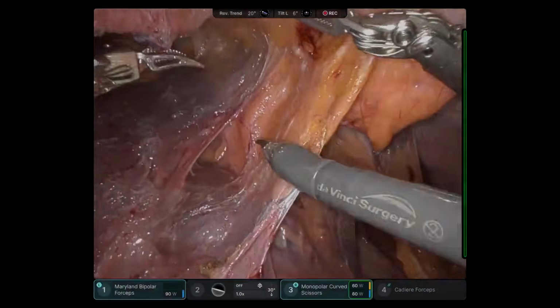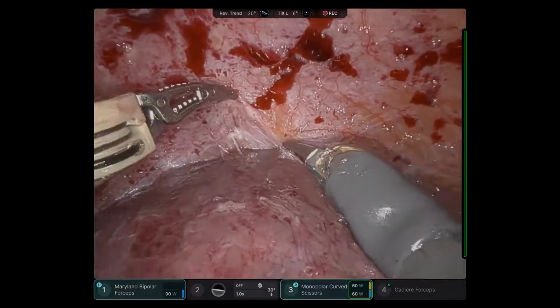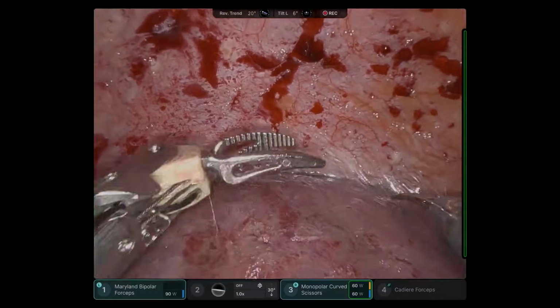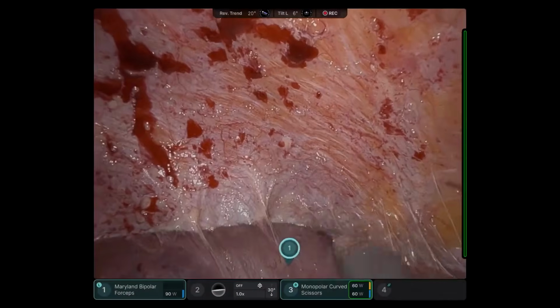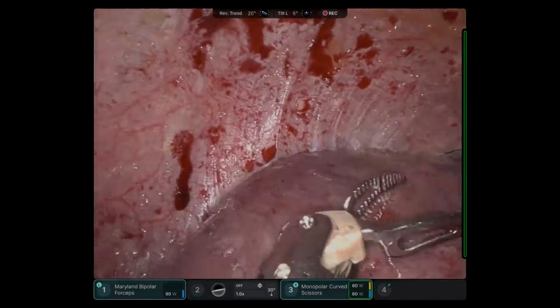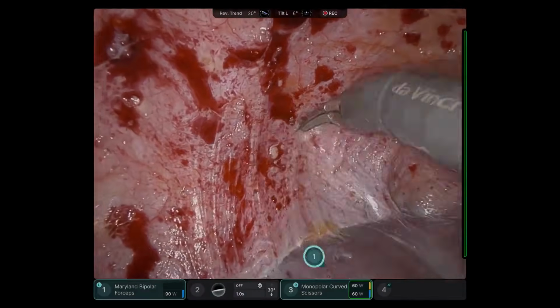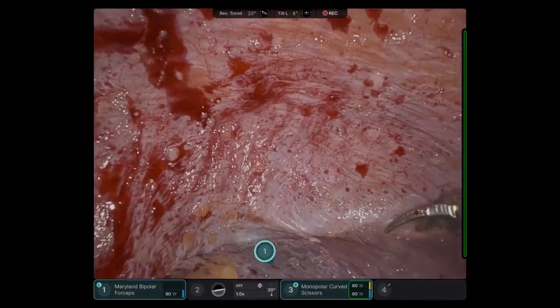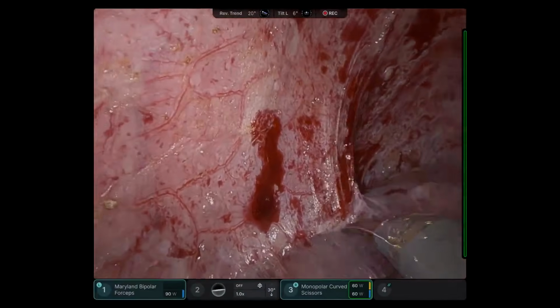That's the falciform, so the area to the left of the falciform is segment 4 of the liver, or to the left of the screen, I meant. Right side of the falciform. So I knew it was located posteriorly, again at the level of segment 7 of the liver. So I had to dissect as much as possible, trying to tease off whatever will come off. Again, you have 3 IR drainages that will make it smaller, but it will never disappear completely.